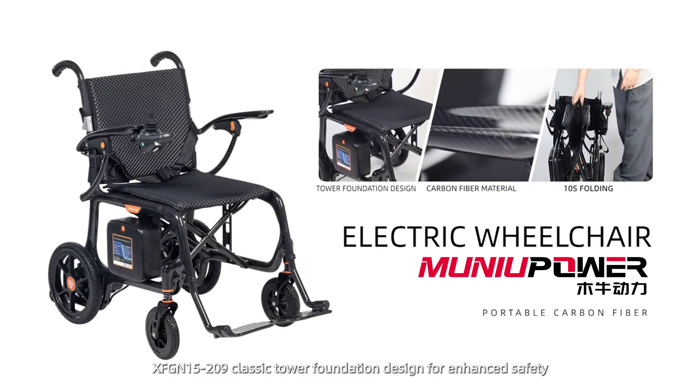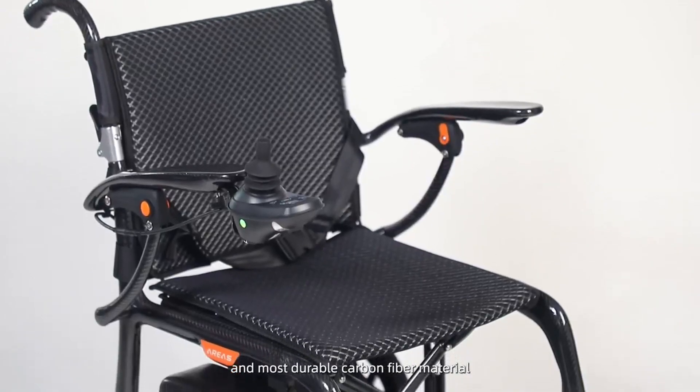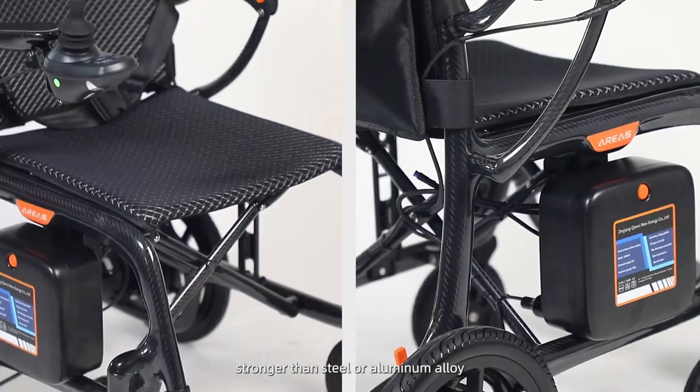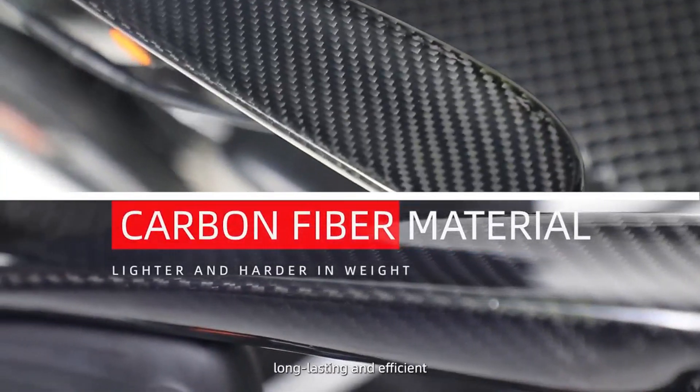209 classic tower foundation design for enhanced safety, made from one of the lightest and most durable carbon fiber materials, stronger than steel or aluminum alloy. Two 150-watt brushless motors for quiet operation, long lasting and efficient.